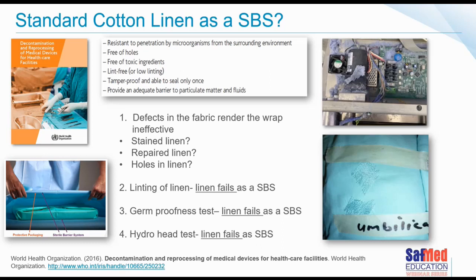Of course, we know sterile barrier systems should be used in 2 layers, depending on what it is we are wrapping or enclosing, and we'll go into that in webinar 3 and webinar 4. So if one of those layers is a layer of linen, please think through that.